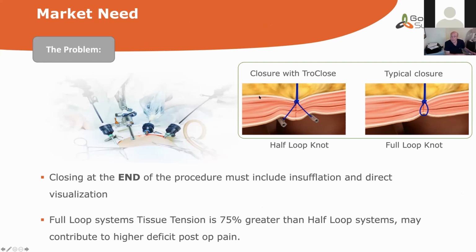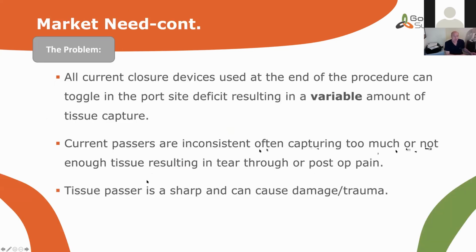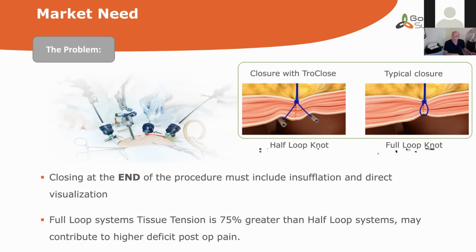So when you close with this trocar closure device, once you place the trocar, you already have two sutures in place on both sides, and they have anchors on both sides. Every anchor and suture is absorbable. So when you finish the procedure, you just need to close them, and they will absorb from 3 to 6 months later. This is the typical closure that you have, like a full loop knot. Here you have the half loop knot, but you have the anchors there. So when you close at the end of the procedure, you will need insufflation. Here you don't. You need direct visualization. Here you don't. Also, if you understand well how the loop system compares to the half loop knots, you create much more tension.